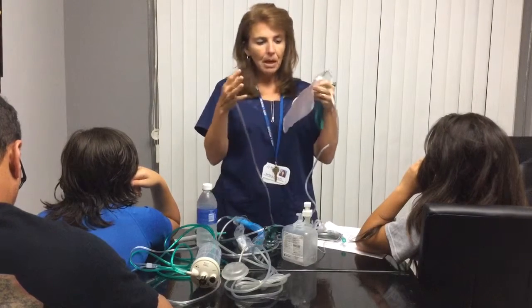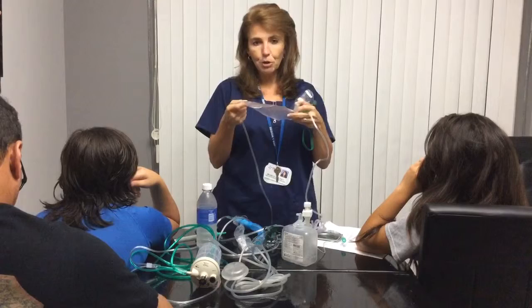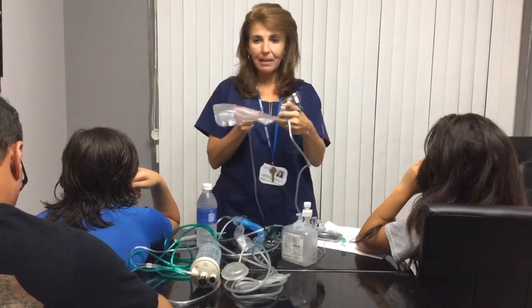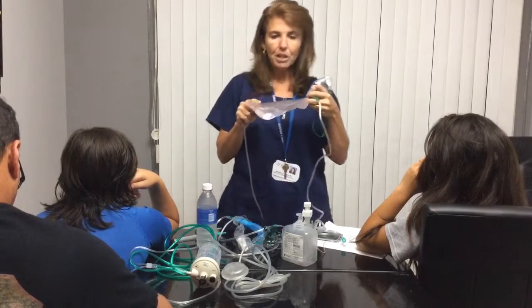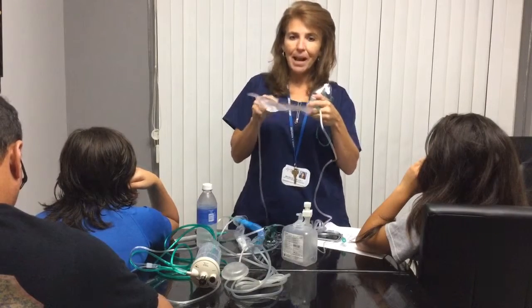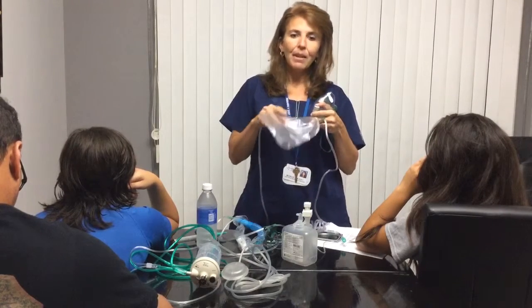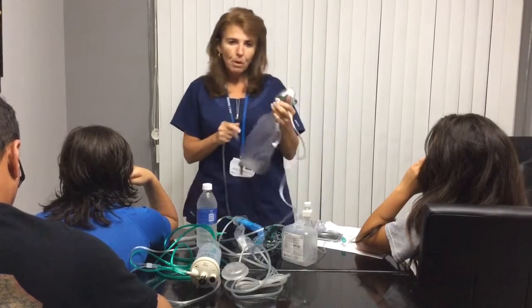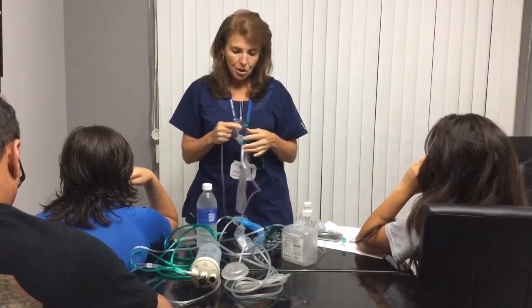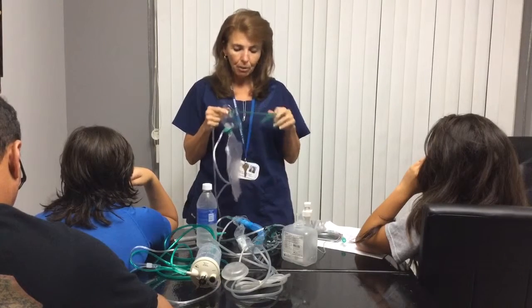If it's overinflated, then you have too much flow. Likewise, if it's flat like this, you have no flow or not enough flow. What you want to achieve is when the patient takes a breath in, that the bag collapses halfway down and then refills as the patient exhales. As I said before, this gives you about 100% oxygen, so it is for the more critically ill patient.